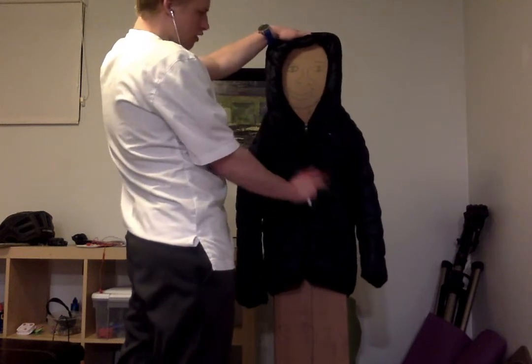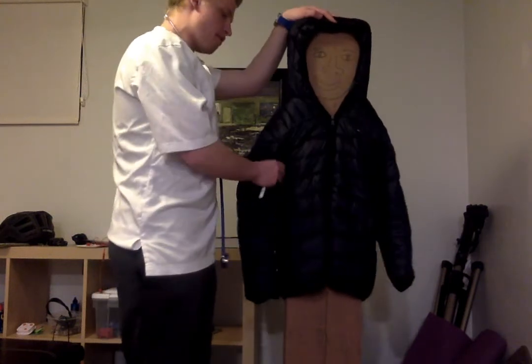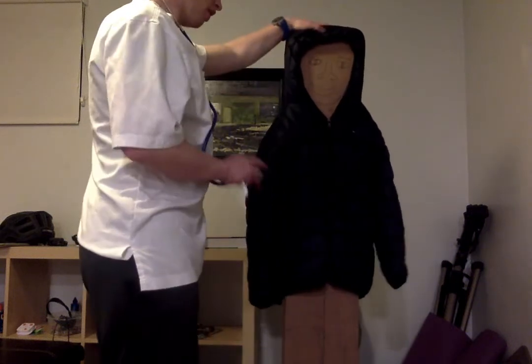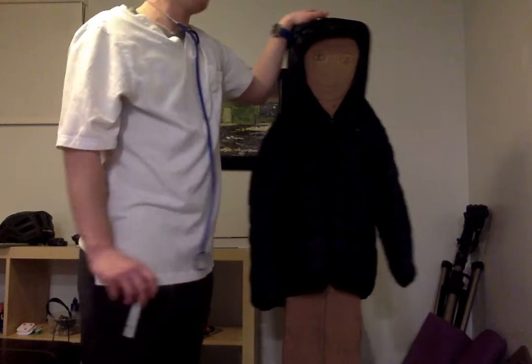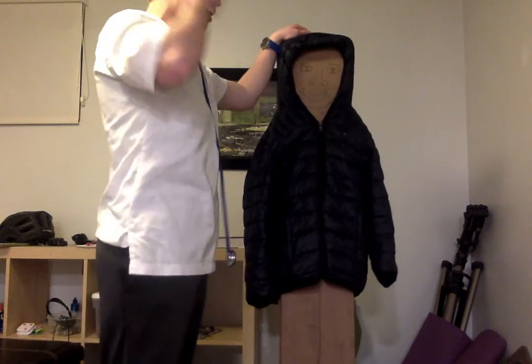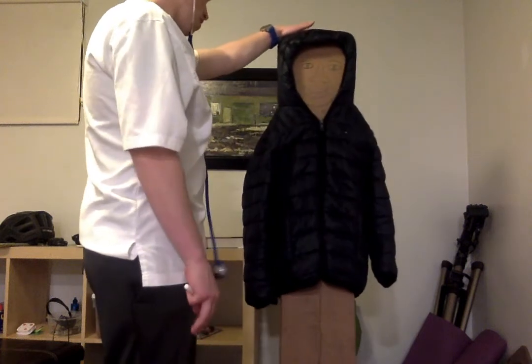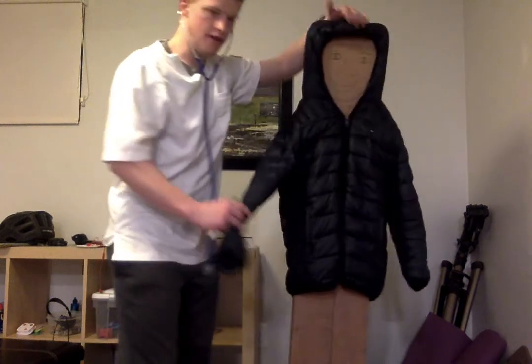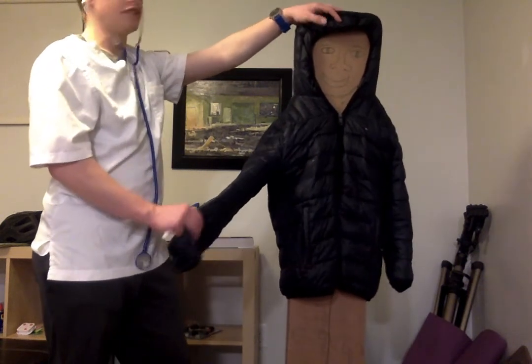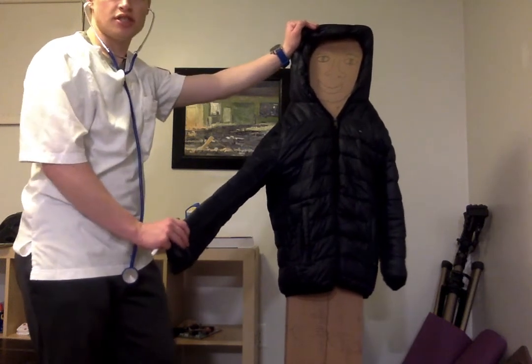Feeling around. From here, this would probably be a good time to do some vital signs. So we could get his blood pressure. I'd put this over the brachial artery, pump it up until we occlude that, then get it to maybe 160, and then listen for those Korotkoff noises, and record that. Let's say it sounded great. And then also I'd have my watch here looking at it, and I do the first 30 seconds counting that pulse, and then I trick him for the rest of the minute and count respirations.